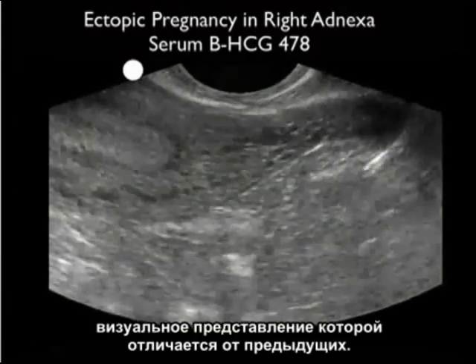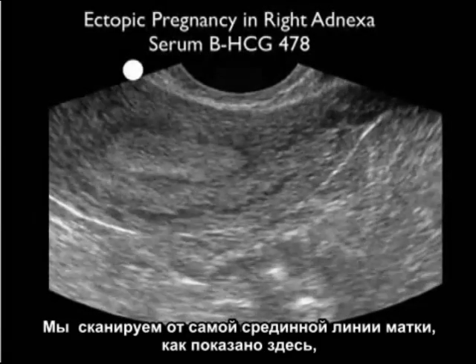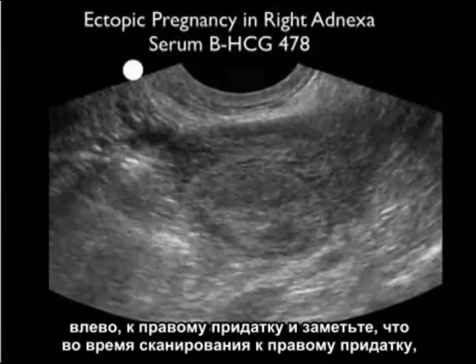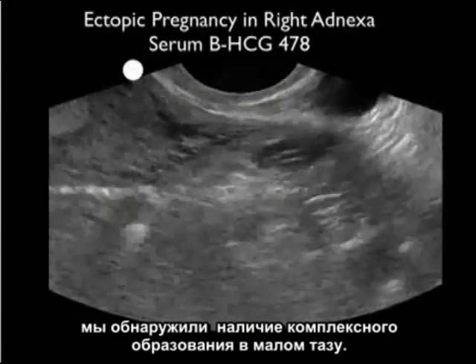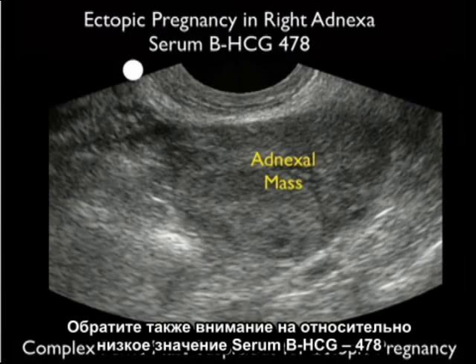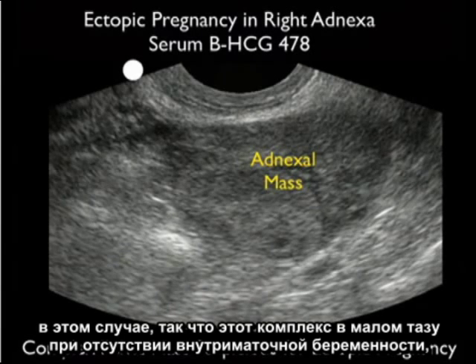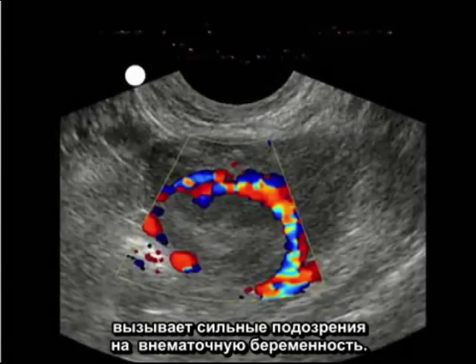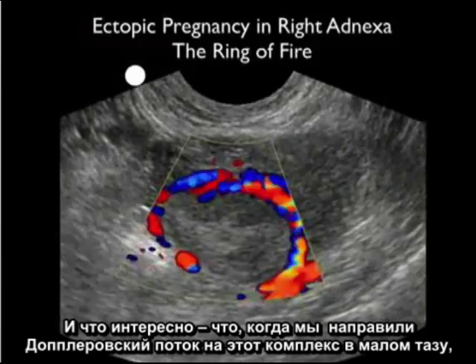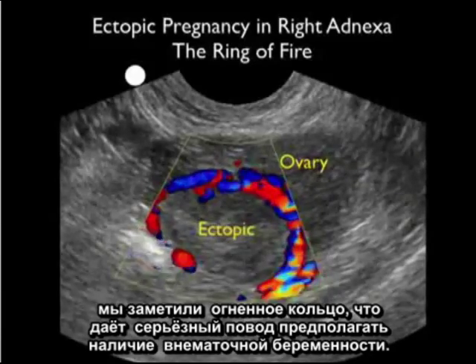Here's another patient with a different presentation of ectopic pregnancy. We're scanning from the midline uterus out to the right adnexa, and as we scan out, we notice the presence of a complex pelvic mass. Notice also the relatively low serum beta-HCG in this case at 478. A complex pelvic mass with an absence of an intrauterine pregnancy is very suspicious for an ectopic pregnancy. As we apply Doppler flow on that complex pelvic mass, we notice the presence of the ring of fire, very suggestive of an ectopic pregnancy.